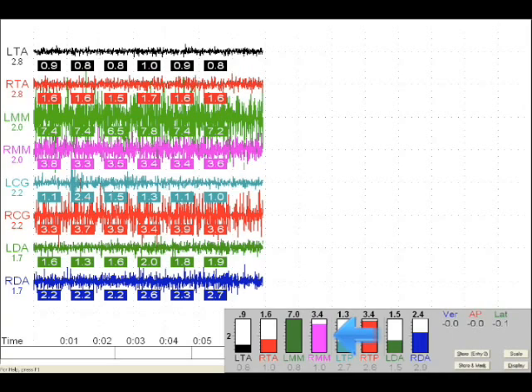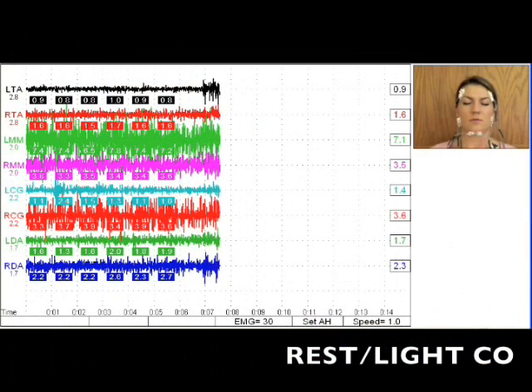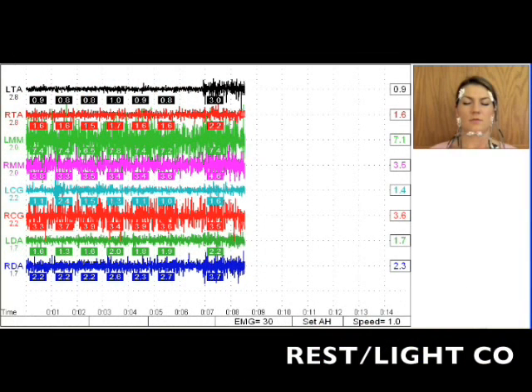Again, we don't want the patient clenching or biting, but just touching lightly. Now press the space bar to start recording the EMGs in LightCO.